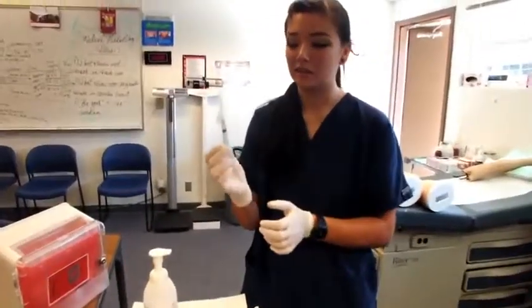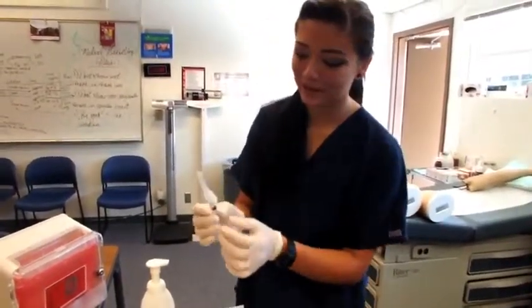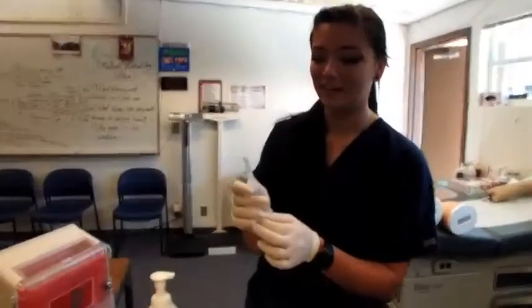CDC needle stick injury prevention. Let's make sure that this has a safety lock. Prevent the needle from being towards your finger.